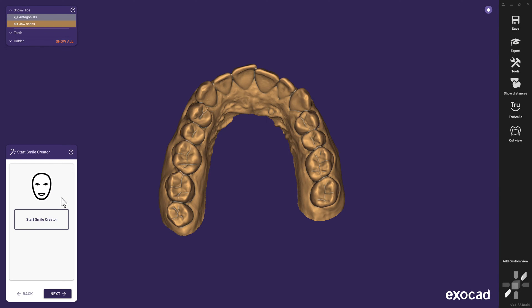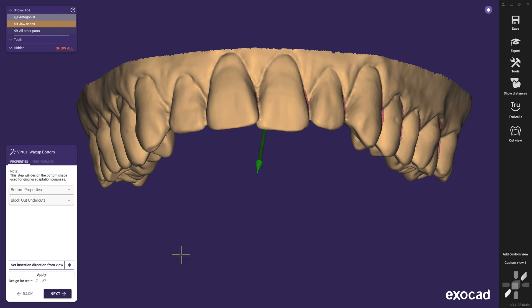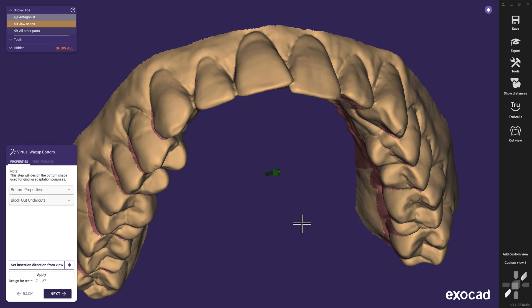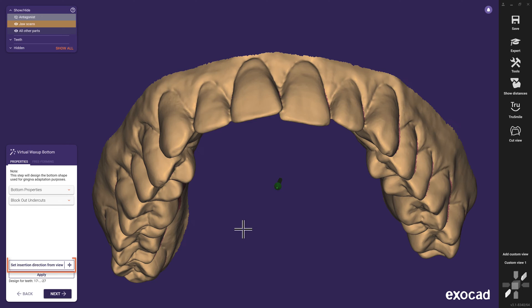The indication mockup works great in combination with a smile creator — a game-changing option, but not mandatory for our mockup. This topic will be addressed separately in a different video tutorial. We like to define the insertion direction from view to create the necessary retention areas to hold the mockup in place. Therefore, we rotate the view to a direction the patient would use for inserting the prototype.